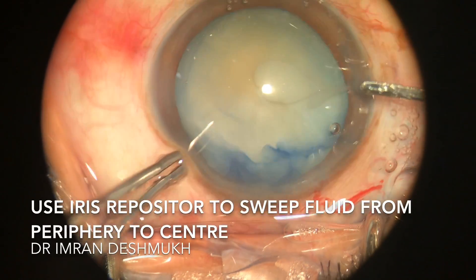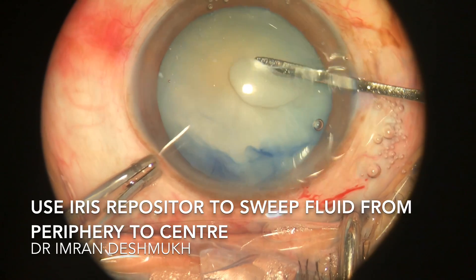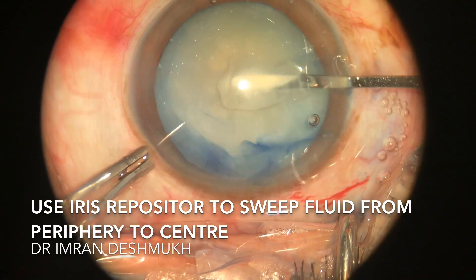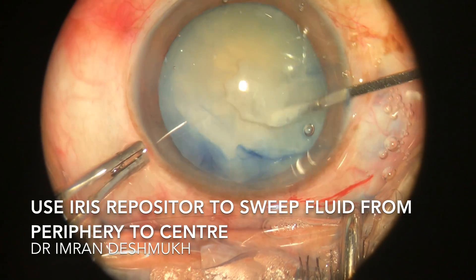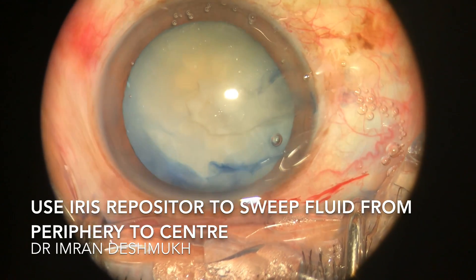Then slowly insert the iris repositor through the sideport and sweep from the periphery to the center. Sweep in such a way that you move all that milky fluid to the center so that it easily comes out through the opening.